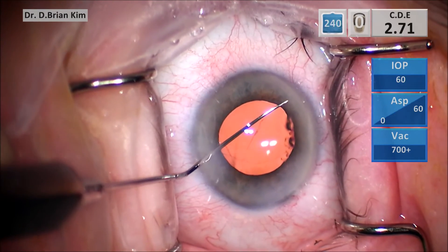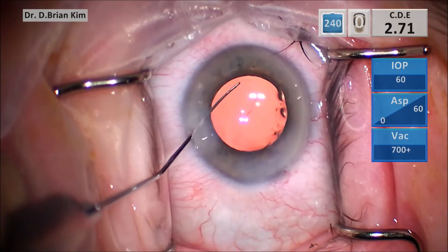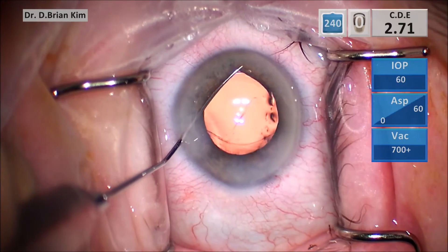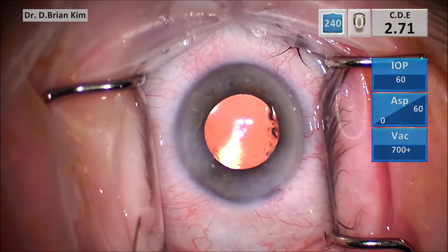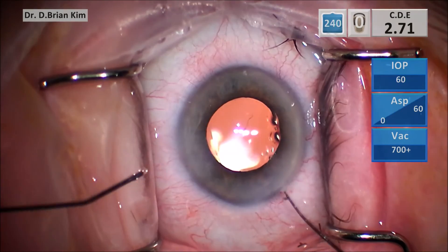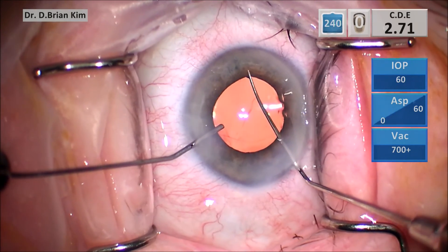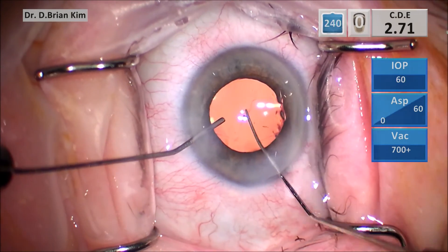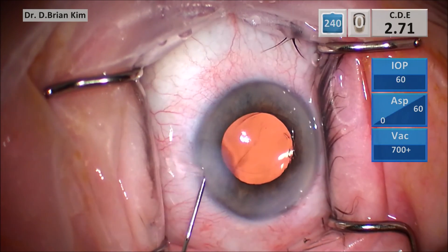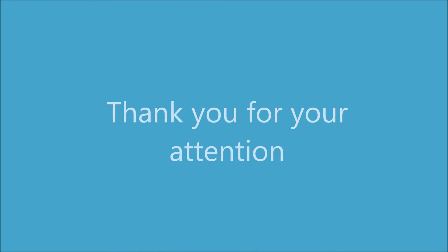To verify the optic capture, you can use a Maltzman instrument. Through the paracentesis site with a fairly stable chamber, you're able to make sure that the nasal optic is captured by the capsule. Alternatively, if you approach through the main incision — because the chamber can become unstable — I recommend using a BSS cannula to gently push BSS into the eye as you retract the iris with the Maltzman. These are my techniques on how to perform reverse optic capture easily and safely. Remember to push BSS when you make the maneuver and use your cannula and your Maltzman.